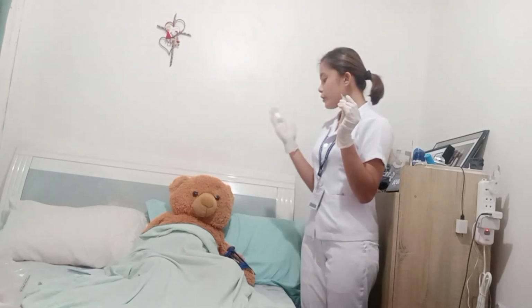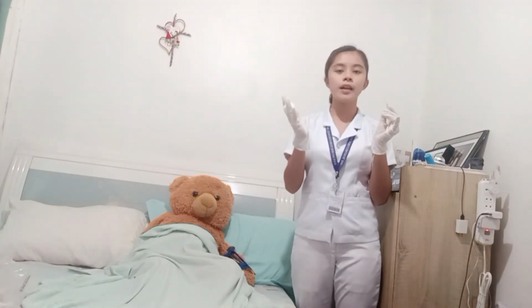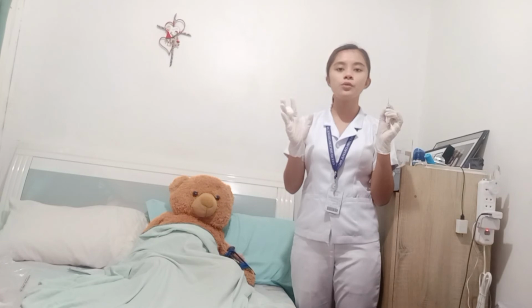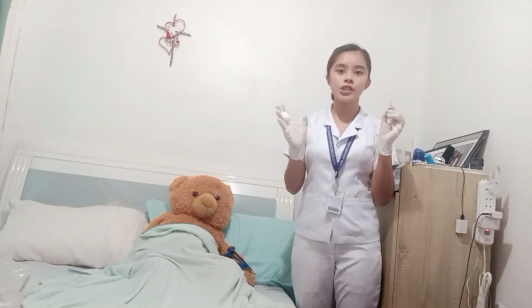Now place the ulnar side of the non-dominant hand just below the injection site and pull the patient's skin laterally about 1 to 1.5 inches. Hold this position until the needle is inserted.